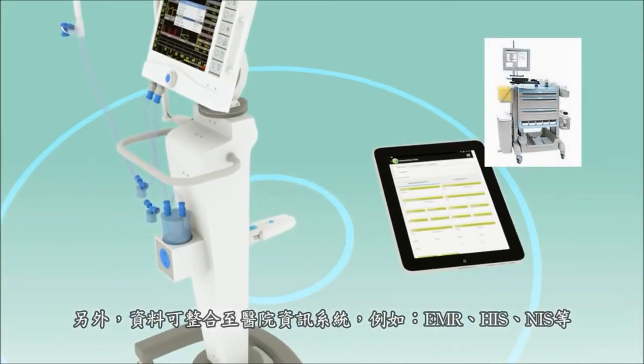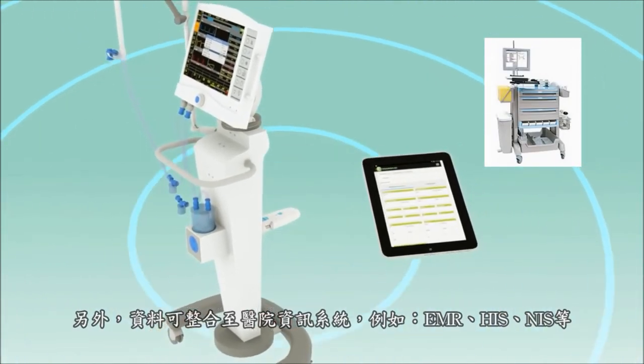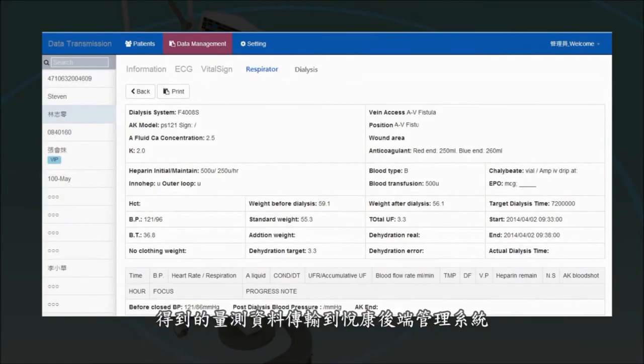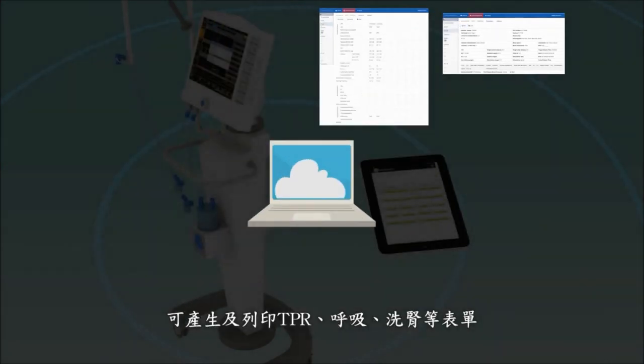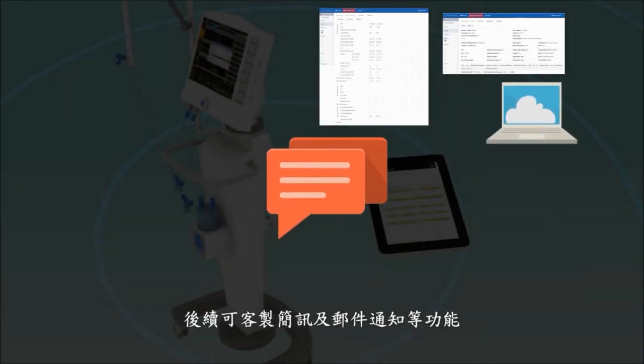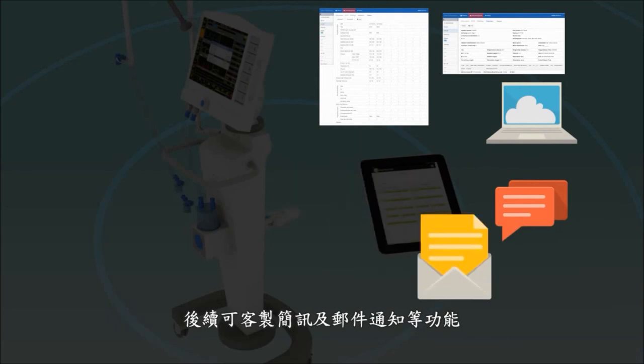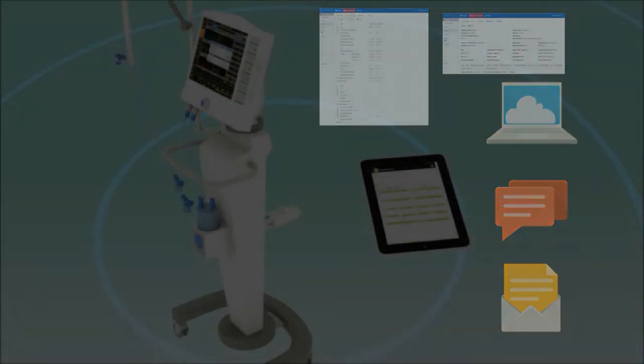All data can be sent to intra-hospital systems such as EMR, HIS, or NIS, or to Uekong Management System for reporting and printing needs. SMS and email notifications can be set up for real-time alerts to improve patient safety.